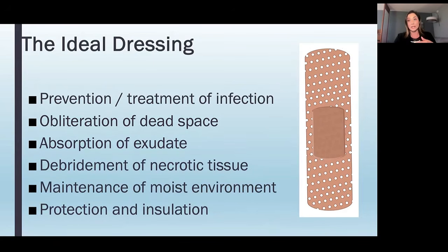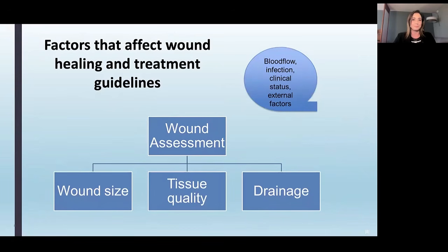So sometimes I say we're protecting the wound from the patient, because there's certainly home environments that are less than ideal. I think of our patient population that is housing. Housing is an issue. We have to worry about where they're changing their dressings or when they're walking around. But I just think of it even with my kids, like if they get brush burn and then they're putting sweatpants on and they get all that lint in there. Or I think of my patients that just put socks over their foot wounds and there's that bright yellow fall sock lint clustered up in there after the fact. So that's stuff we don't want in the wound bed.